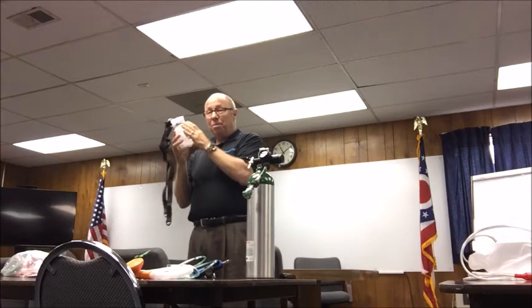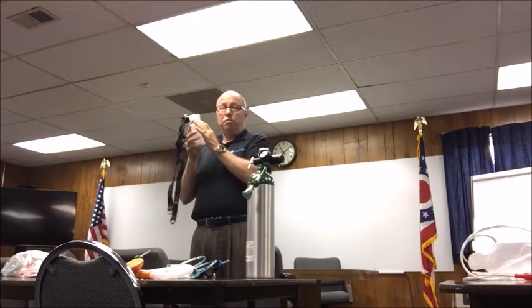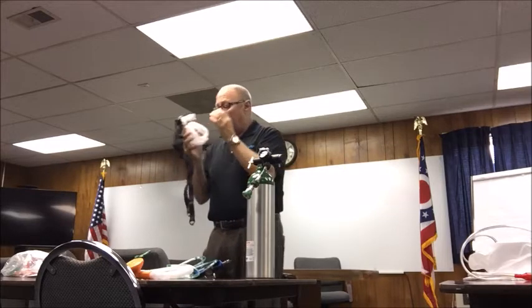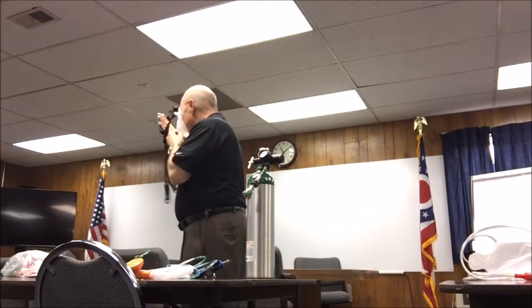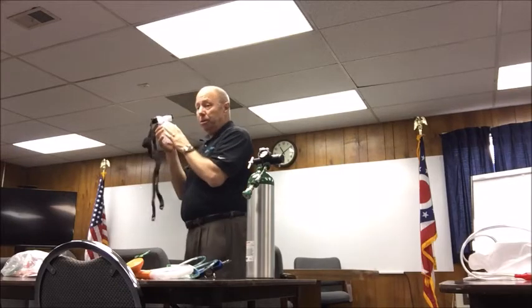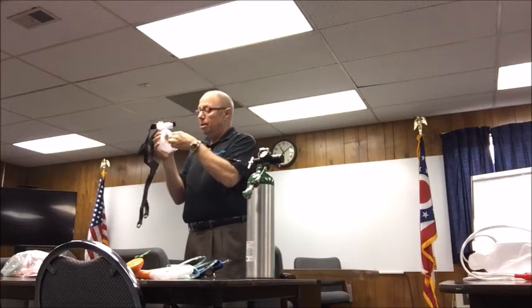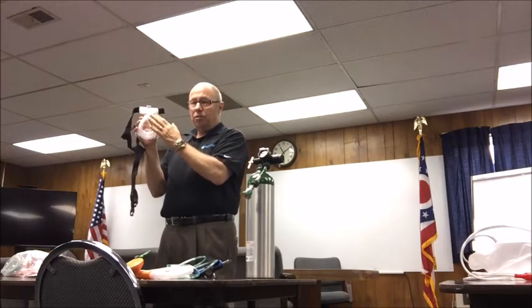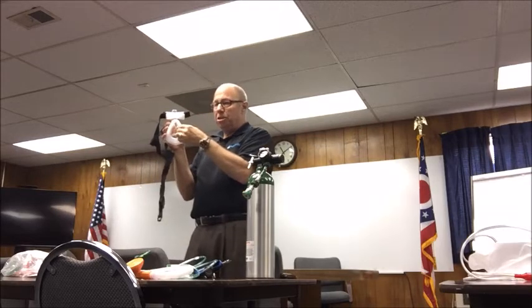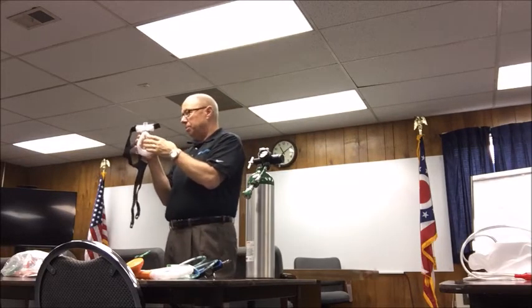Conversely, with this mask, you don't need a lot of pressure. In fact, I call this a floating mask. I literally can put this on and I don't have hardly any pressure on this mask, and I have a really, really good seal. The reason why that happens is there's two layers on this mask. The inward layer is for stability. The outward layer is for comfort. And actually, when the mask is pressurized, it blows against the patient's face, kind of like a skin diving mask.